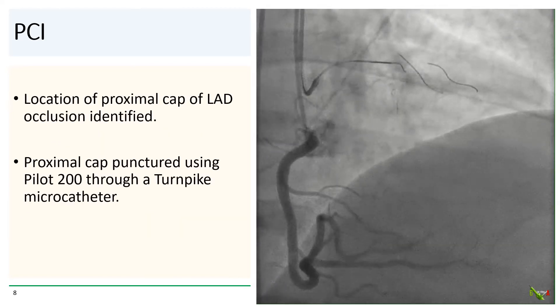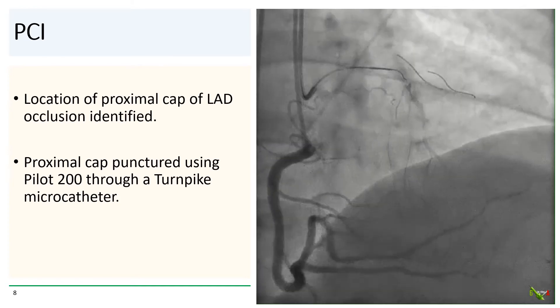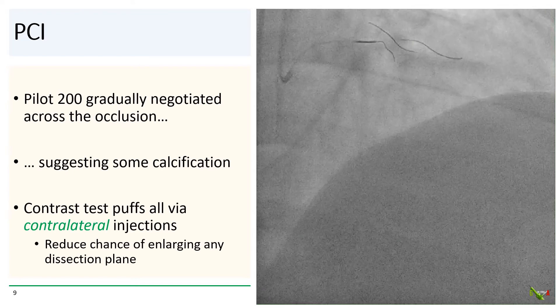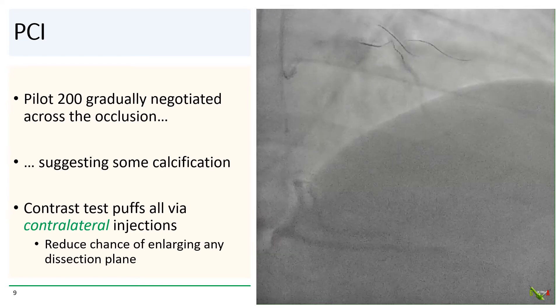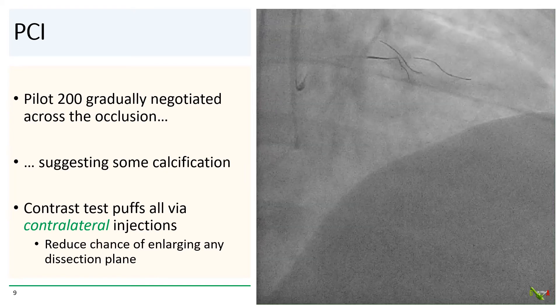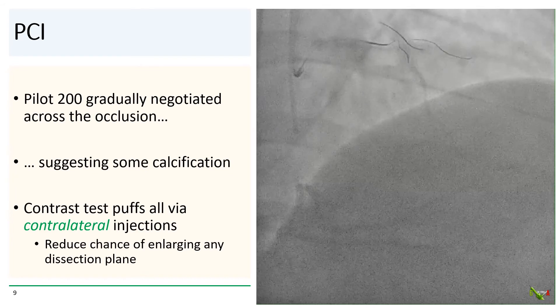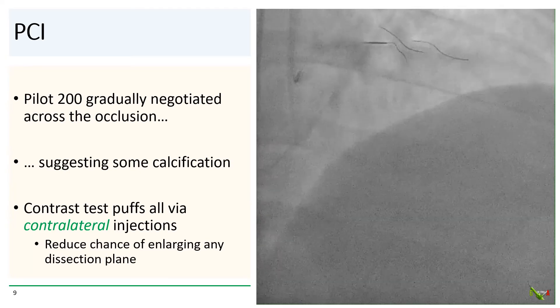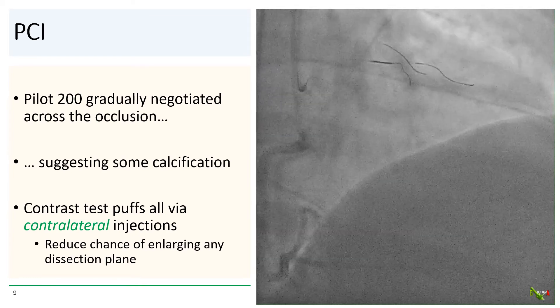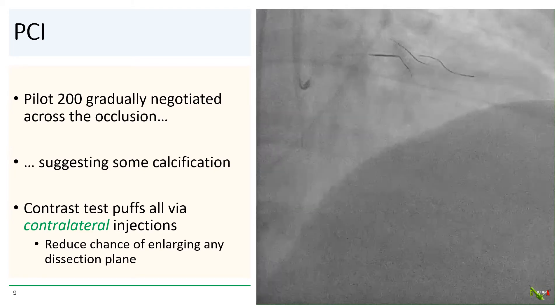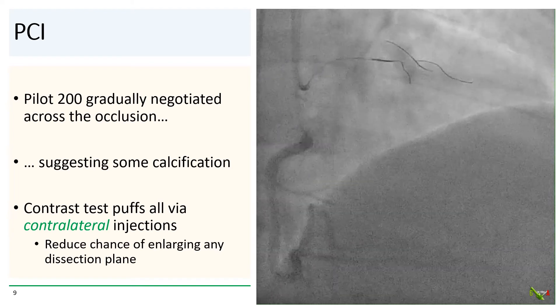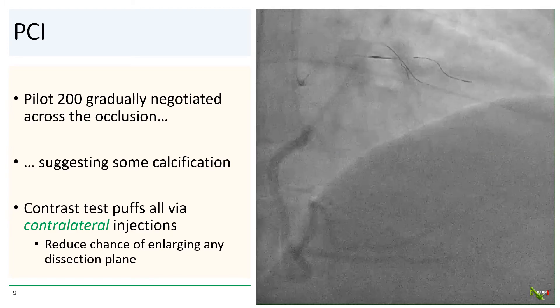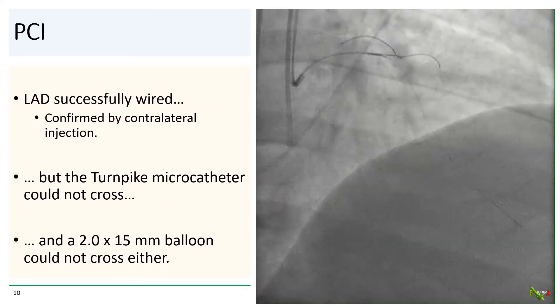With contralateral injections, we identified the location of the proximal cap of the LAD occlusion, and punctured it with a pilot 200 wire via a turnpike microcatheter. Quite often, at least in more subacute occlusions, after the proximal cap is punctured, the wire quickly sails across the occlusion and enters the distal vessel. But unfortunately, this was not true in our case. We had some difficulty negotiating the pilot 200 wire across the occlusion, suggesting that the lesion is at least somewhat calcified and is probably more chronic than subacute. Note that until we were sure that we crossed the lesion, all contrast test puffs at this point are done with contralateral injections. That's because if we happen to be in a subintimal location in a dissection, antegrade injections at this point could enlarge the dissection plane and make it more difficult to get back into the true lumen.